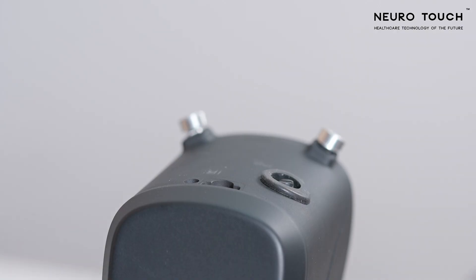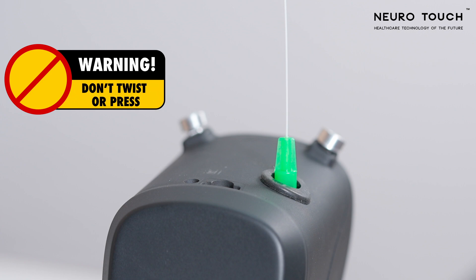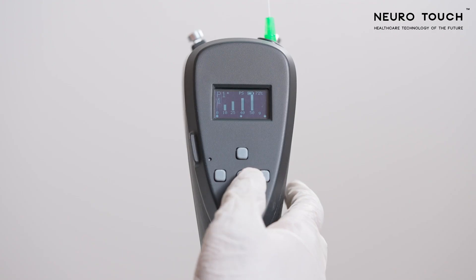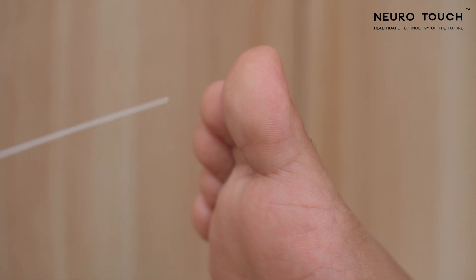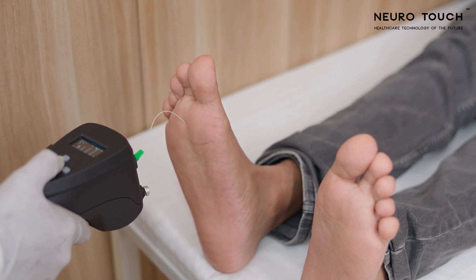Start every test point with the green monofilament. Place the monofilament gently on the monofilament holder. Do not twist or press the monofilament too hard into the holder. After placing the filament, the bar chart will fill up. Reset the data by clicking the center key and the left key. Now gently press the monofilament on the patient's test point and take feedback from the patient.